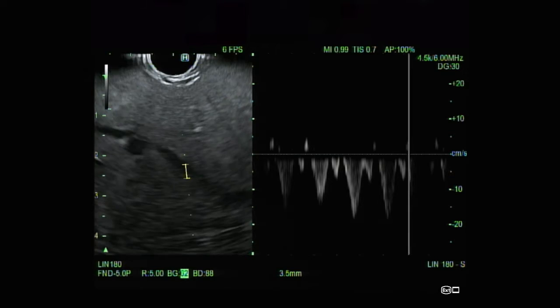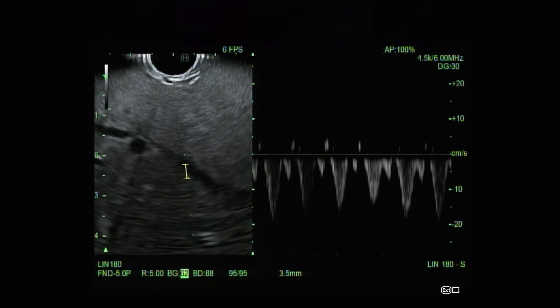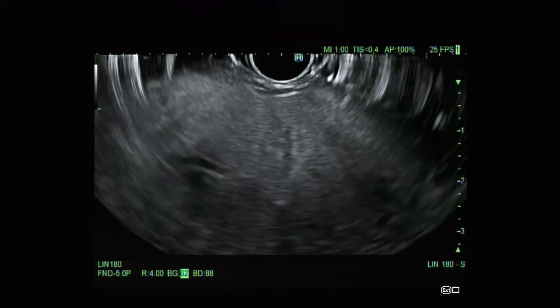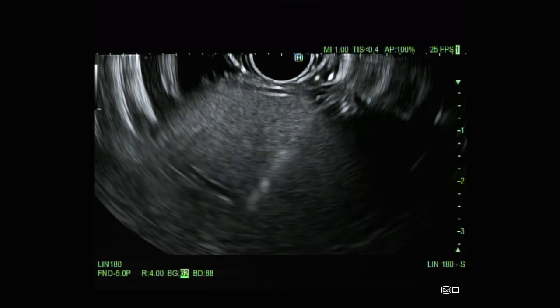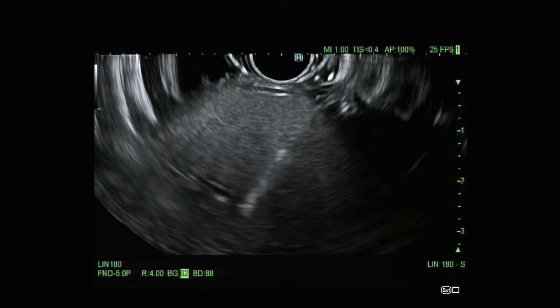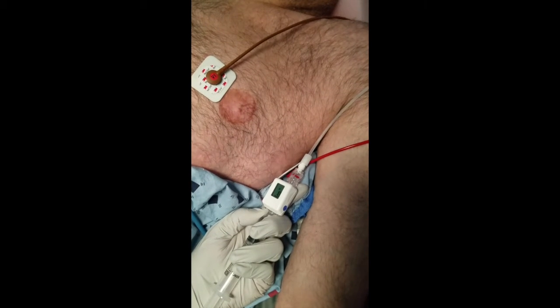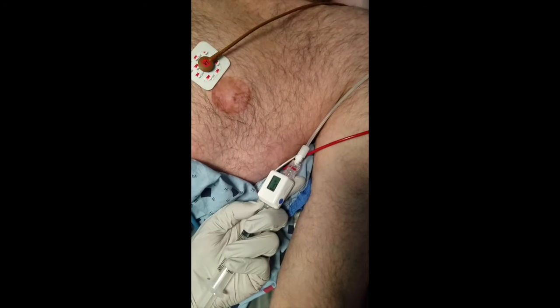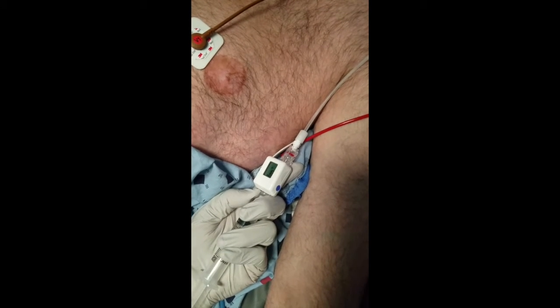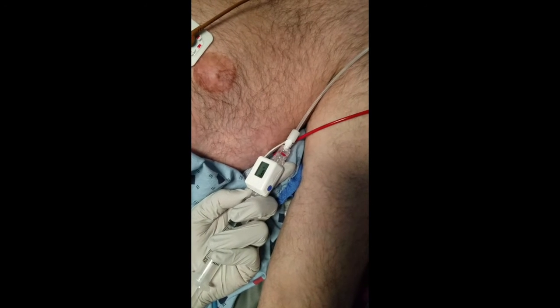The middle hepatic vein was first identified using Doppler flow with a characteristic four-phase waveform. Using a transgastric approach, the hepatic vein was then punctured. Once the needle tip was seen within the vessel, approximately 1–2 cc's of heparinized saline was used to flush the needle, confirming adequate position within the vessel on EUS. The pressure reading on the manometer was obtained and recorded once stable. This process was repeated a total of 3 times, including repeat flushes of heparinized saline each time, to obtain the mean hepatic vein pressure measurement.